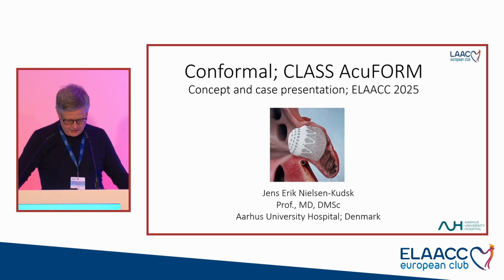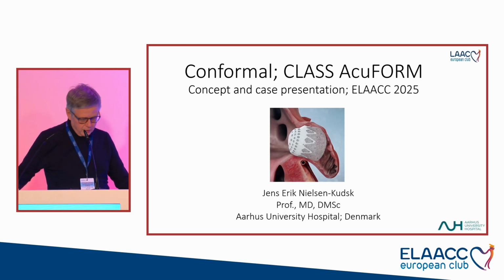So this presentation is not only about intra-procedural imaging, it's also about a new device, the Conformal device.